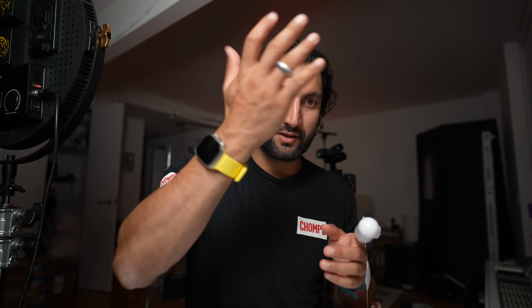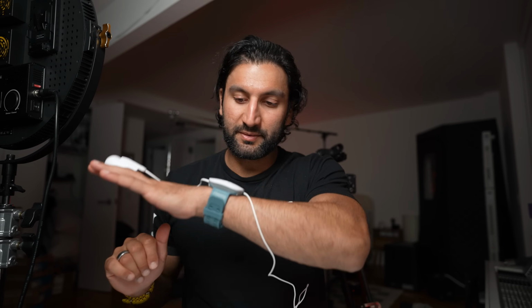I'm gonna go to bed. Bed is behind me. And we'll see what happens when I sleep tonight. I'm also wearing my other wearables here, but this is specific to sleep apnea. We've got the chest monitor. We got the watch and this finger thing. So we're ready to go to bed. Now I just need to keep this next to my bed, but that's pretty much it.